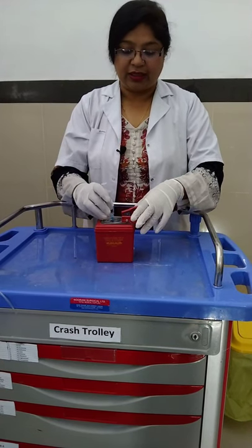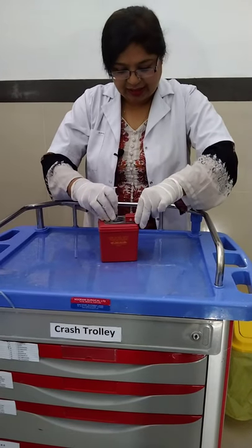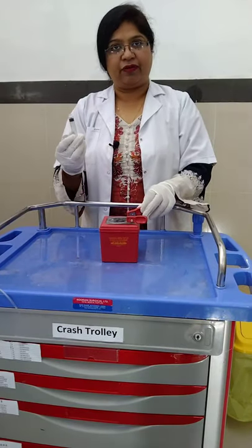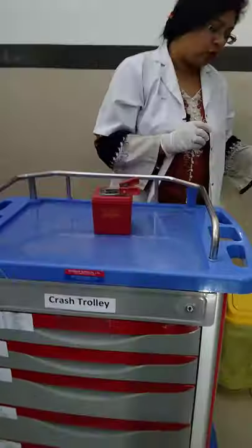After that, the barrel is inserted in the big orifice and then squeeze the handle. The barrel will be cut off. Only the plunger will be left, which will be discarded in the yellow waste bin.